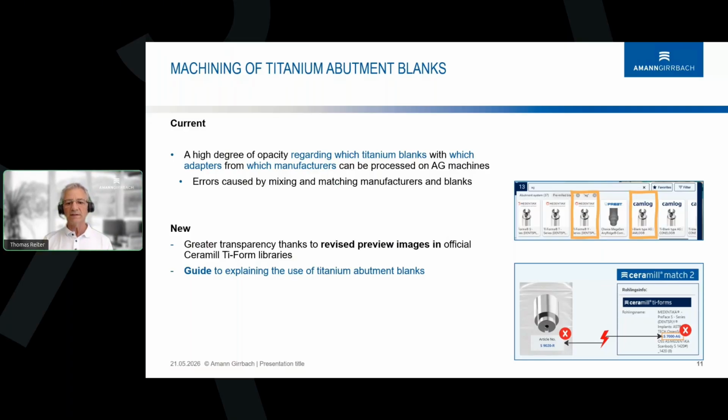Two important points to note here. One is you really have to use the right library. You have the hardware and the software. The software is a library. The library has to be validated. This is also very important in this case at AG for our system.